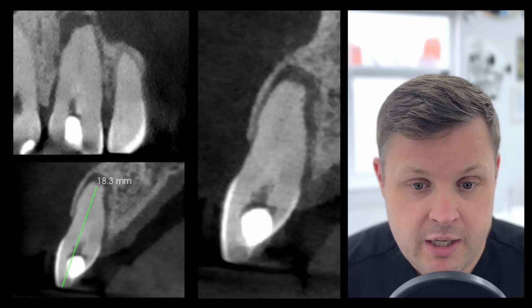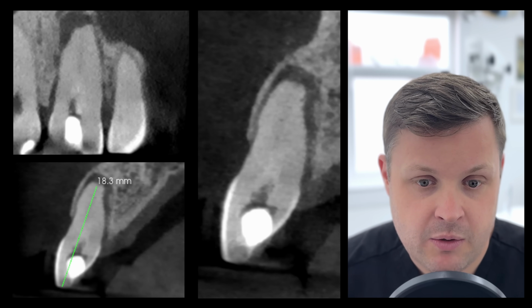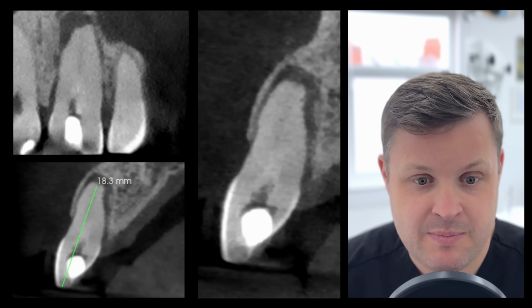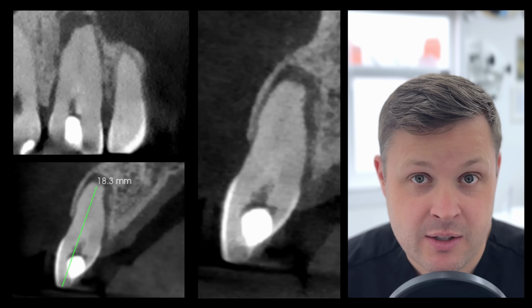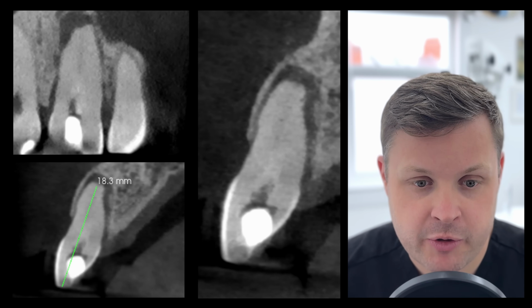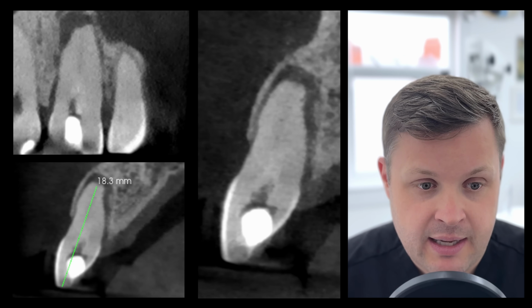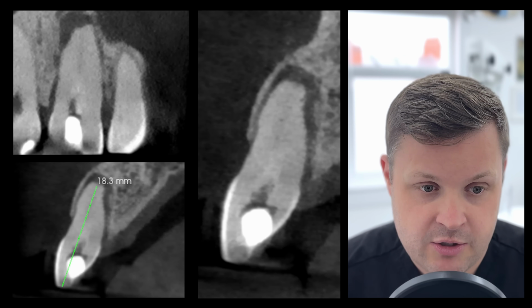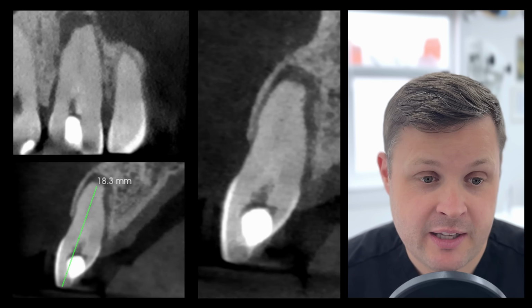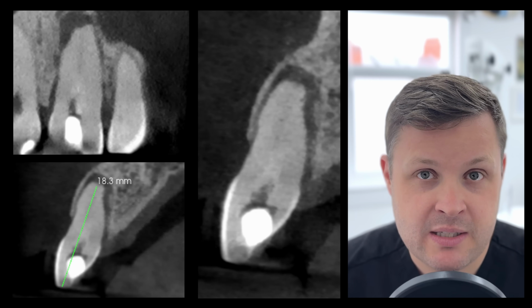It also gives me an indication of what the end looks like, because in a way, what we've got to do is make an assessment to see if this tooth is genuinely restorable or not from a root anatomy point of view. So we can see here that the tooth is about 18 millimeters in length, and the point where we are seeing obvious canal space is probably around 12 to 13 millimeters.